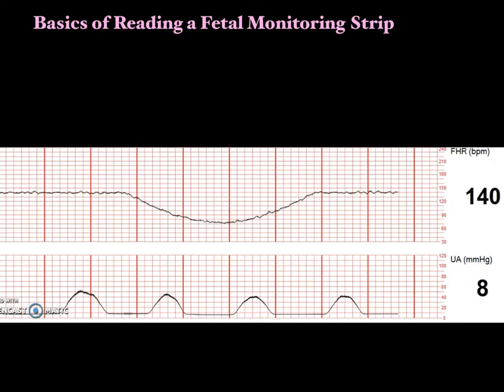Fetal tachycardia, I don't have a picture of that either. But fetal tachycardia would be, again, over 160 beats per minute at the baseline, and causes for that most often are maternal temperature. Sometimes maternal medications will cause fetal tachycardia. I know when we gave terbutaline, we always had to measure the baby's heart rate, and if the baby was tachy, we couldn't give it because it was a side effect. Mom and baby both had like an increase in heart rate.